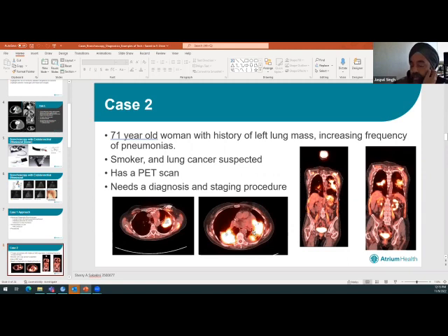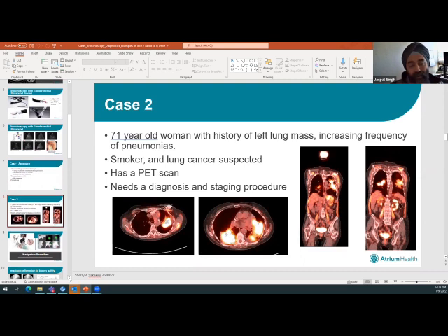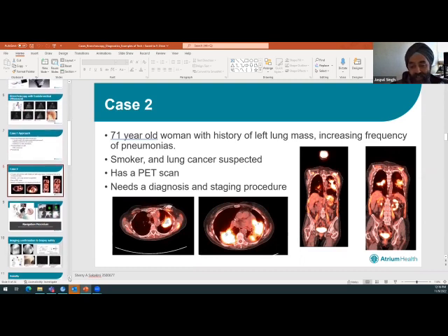And sure enough, in a single procedure with bronchoscopy, we've advanced our bronchoscopy now where these areas are outside the field of vision of our cameras on the inside. But in a single procedure, I can biopsy both those sides safely. Back when I trained, we would try to guess, and most of our patients ended up with a lung collapse. So that wasn't a great way to train, right? So we've gotten much better with that.